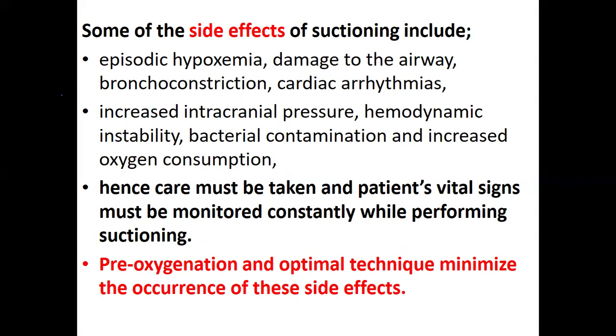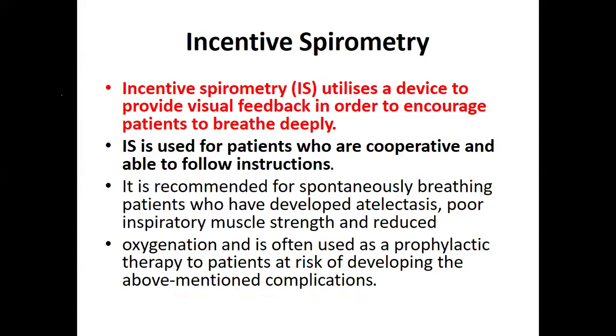Pre-oxygenation and optimal technique minimize the occurrence of these side effects. So before and whilst you are doing suctioning, you intermittently do the oxygenation. You do suction. After an episode of suctioning, you re-oxygenate to 100. Then again, whether you are doing closed or open suction, you continue intermittently like that. You do episodes of re-oxygenation.